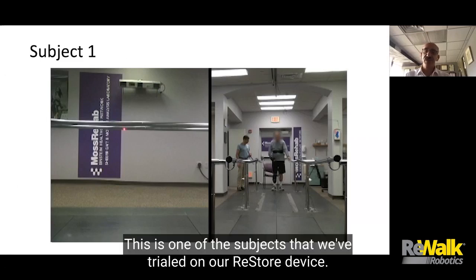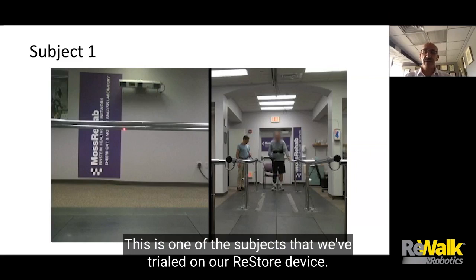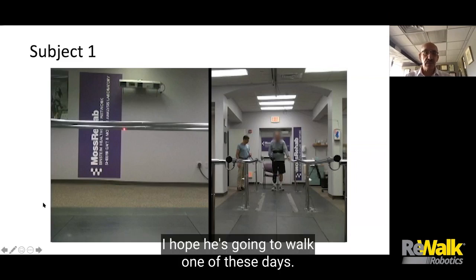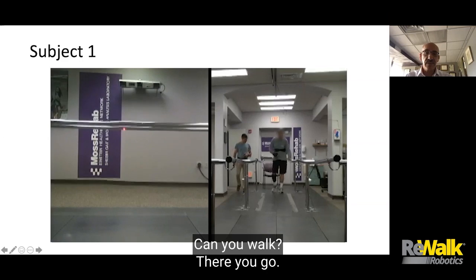This is one of the subjects that we've trialed on our device. I hope he's going to walk one of these days. Can you walk? There you go.